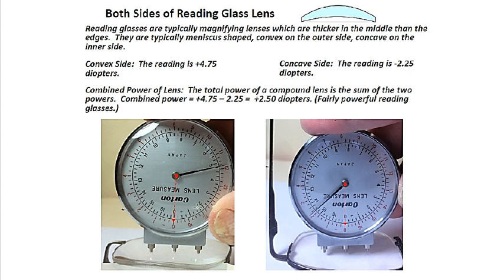So in this case, what we got right here is a positive. You go all the way, and that's a 4. And then down here, from here to here is about 75%. So you get 4.75.